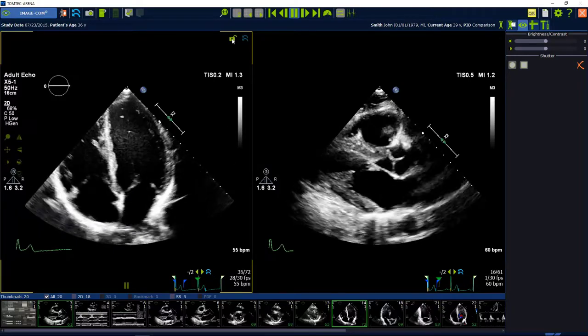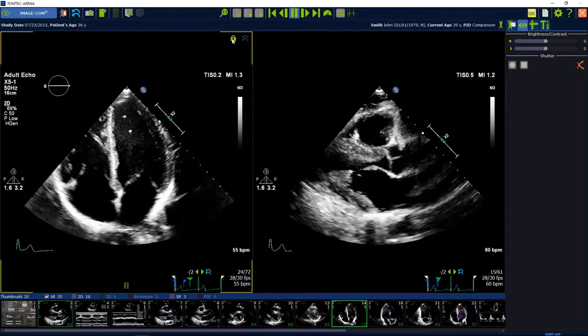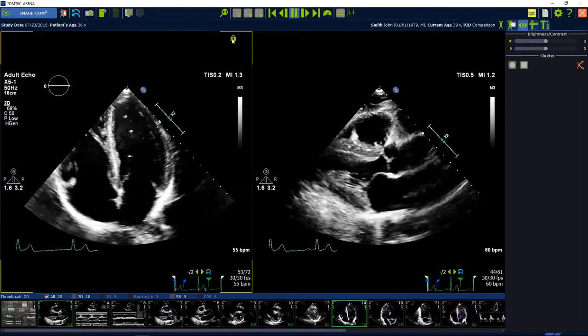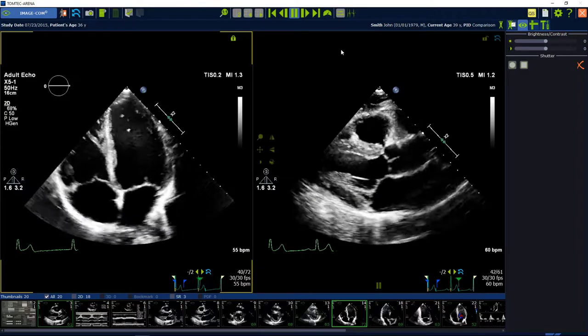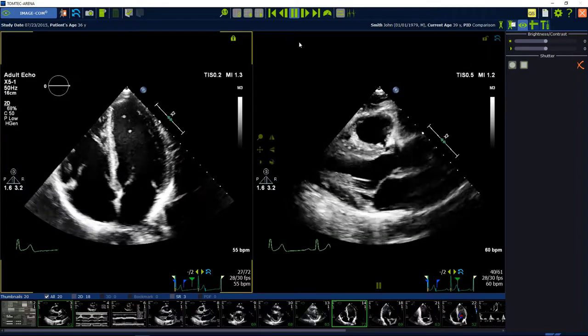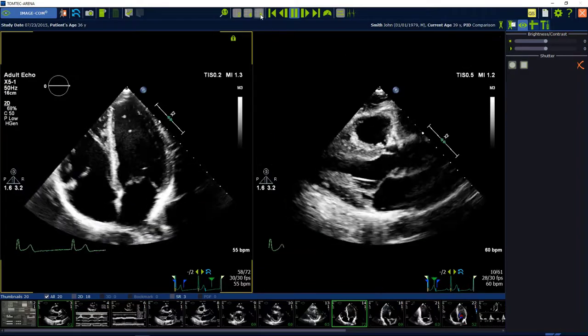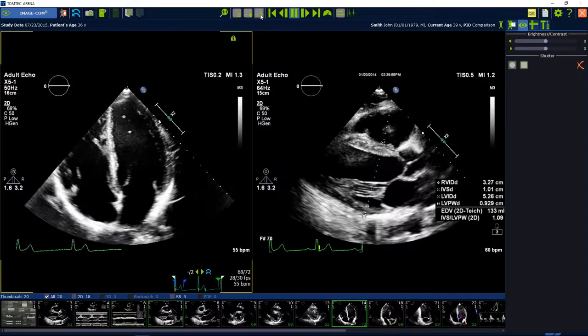The last smart region is the pin option. The pin option pins an image or a clip in its position. This image is not affected by paging through a study.